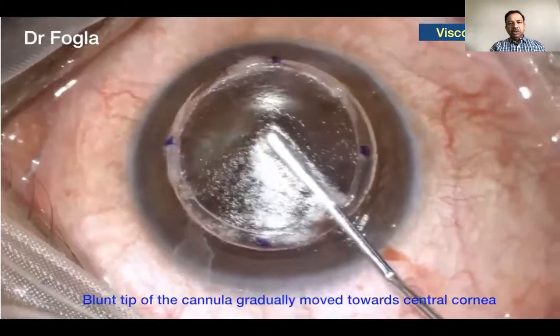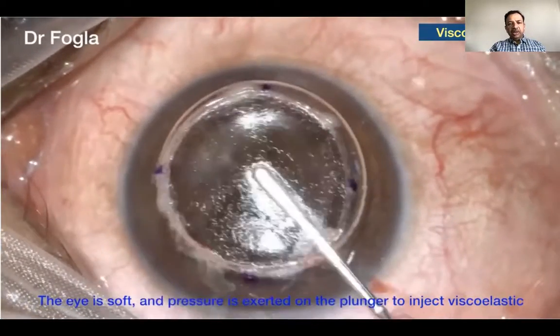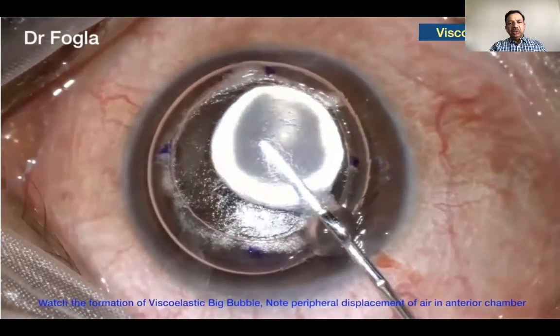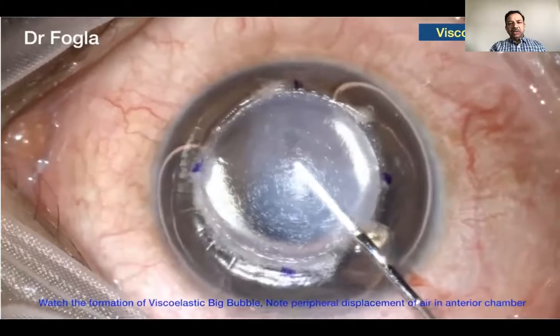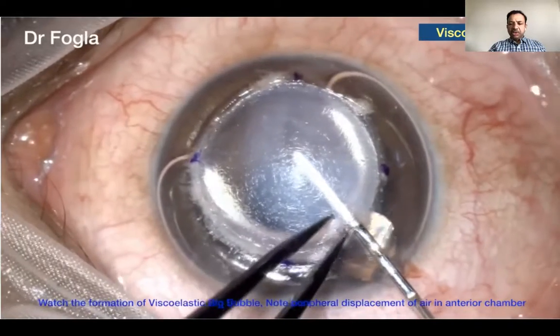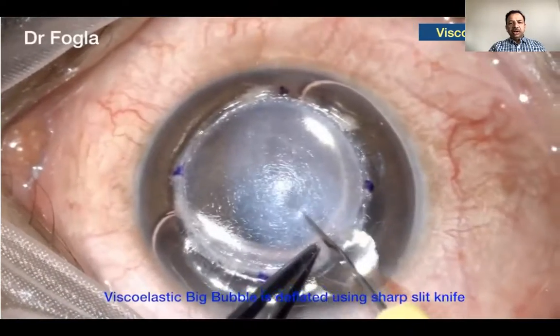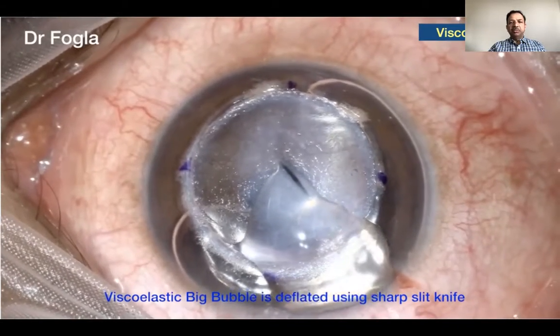Here, showing you the visco bubble, where you introduce a cannula into the deep stroma, and as you inject the cohesive viscoelastic, you get a similar formation of a visco bubble. You can see the air in the anterior chamber getting displaced to the periphery, and you can deflate the visco bubble, and then the rest of the steps are quite similar.